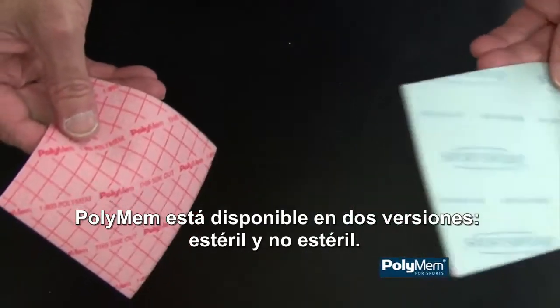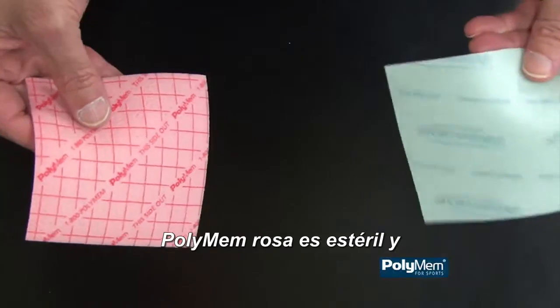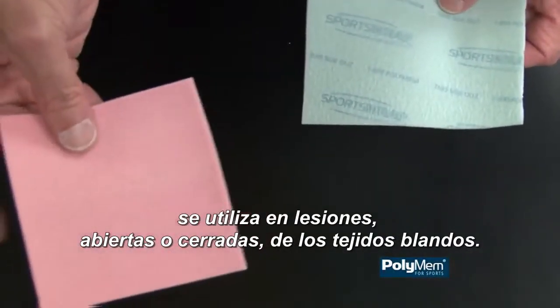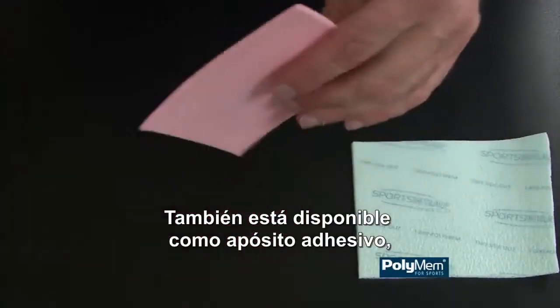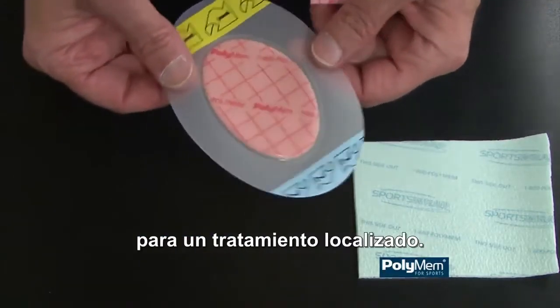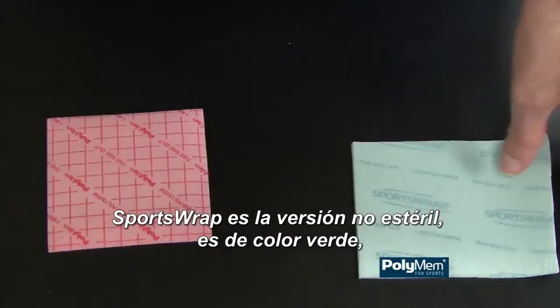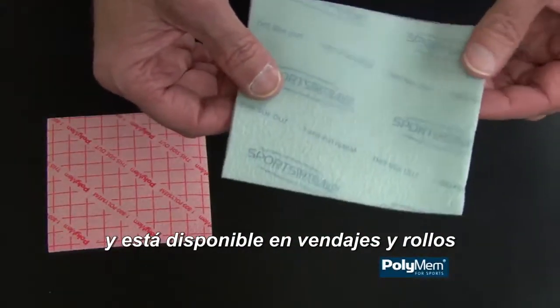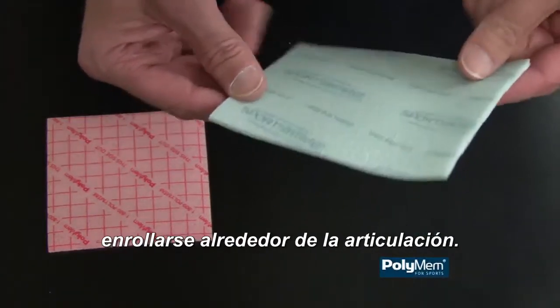PolyMem comes in two versions: sterile and non-sterile. The pink dressing is a sterile dressing that's used for open and closed soft tissue injuries. It's also available as an adhesive dressing in many shapes and sizes for localized treatment. The non-sterile version is green, available in wraps and rolls that can either be cut to size or wrapped circumferentially around the joint.